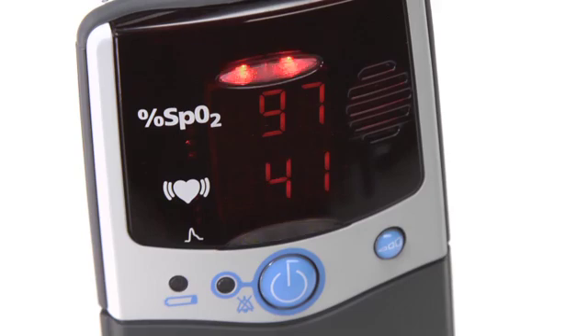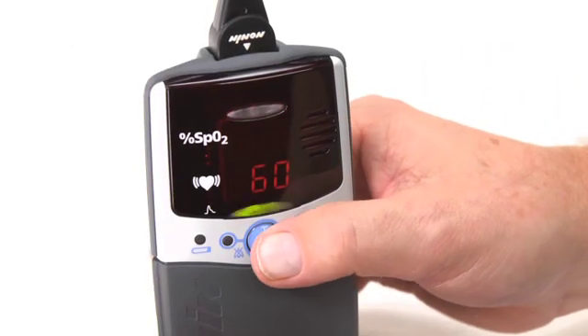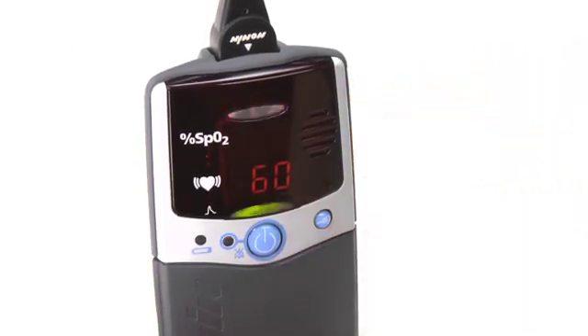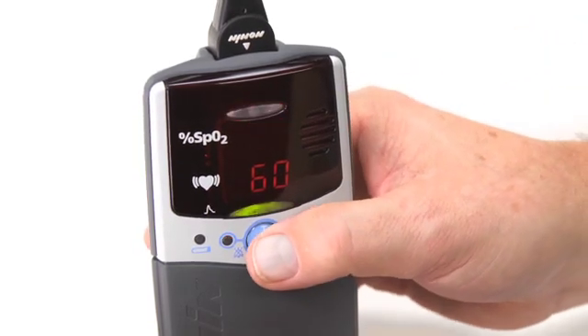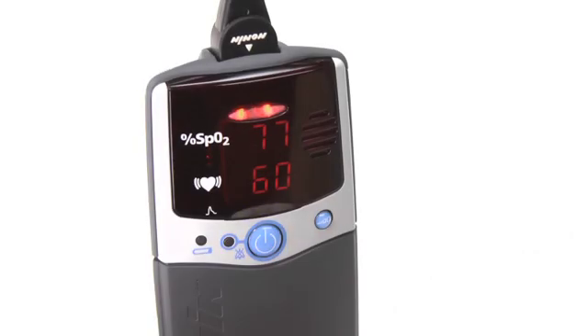The condition that is out of range will flash on the display. You can silence the audible alarm for 2 minutes by momentarily pressing the on-off button. When oxygen level or pulse rate return to the preset range, the alarm will stop and return to normal monitoring function.